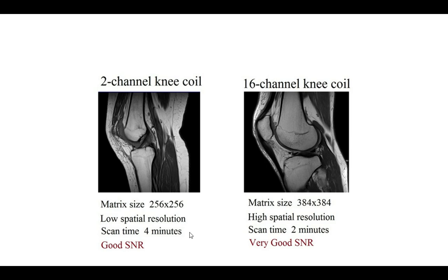Dr. Schubert, if you have more channels in your receive coils, is there any other cost besides just the upfront manufacturing cost? So typically, if they're of a good enough quality that you can get a readout in a decent time, so I don't have to do a whole bunch of repeats, you shouldn't. If they overlap too much, you could actually get some time delays creeping into it.